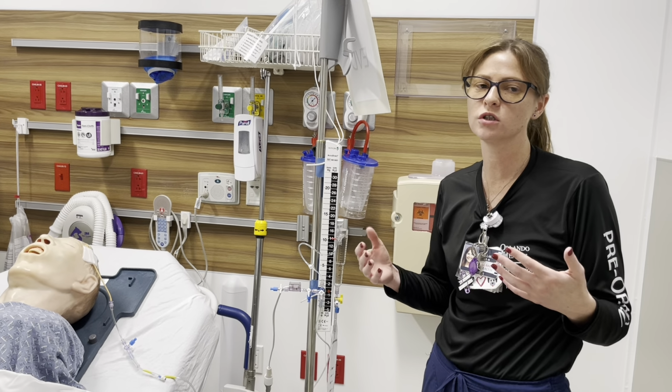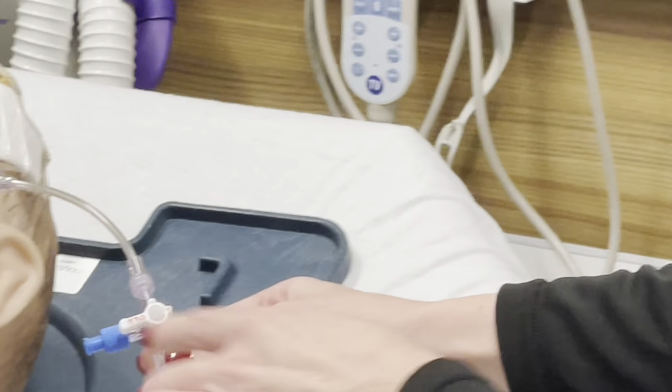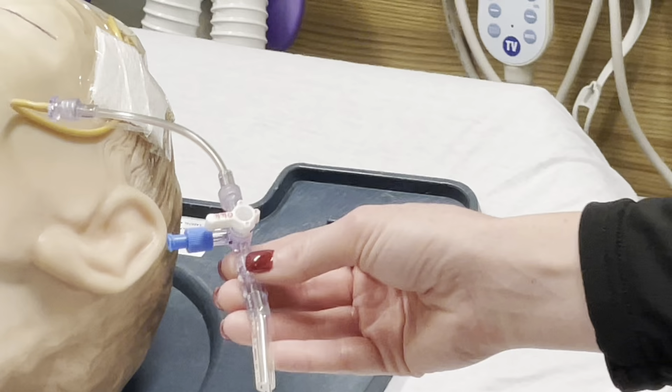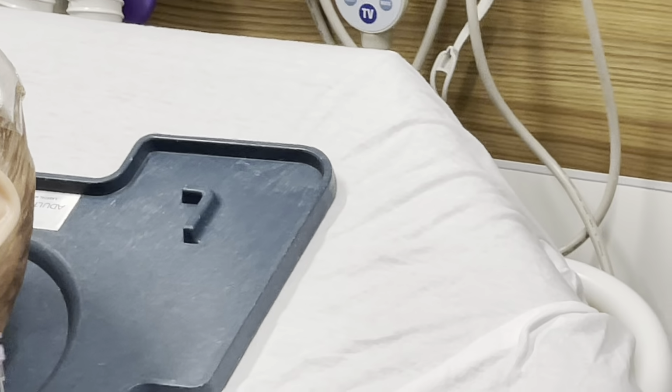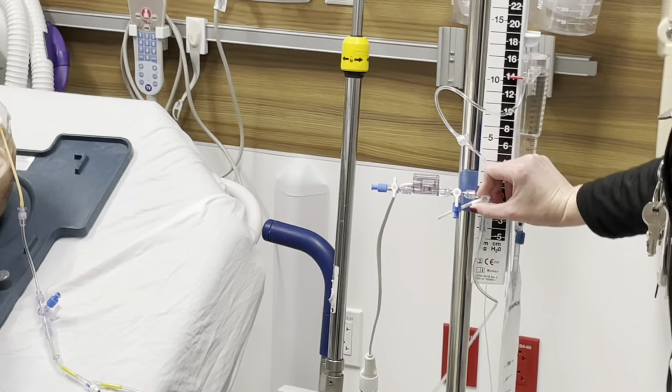So now that we are ready to look at our waveform, you're going to trace back your lines. You can start at your patient, make sure nothing's kinked. You can open it from your patient here. So now you're open to drain. As your stopcock is off this way, you're open to drain, okay? And then over here, you're also going to put it open to drain this way.